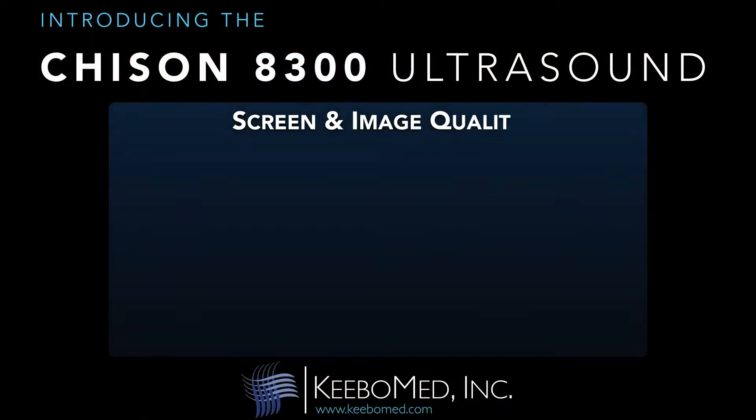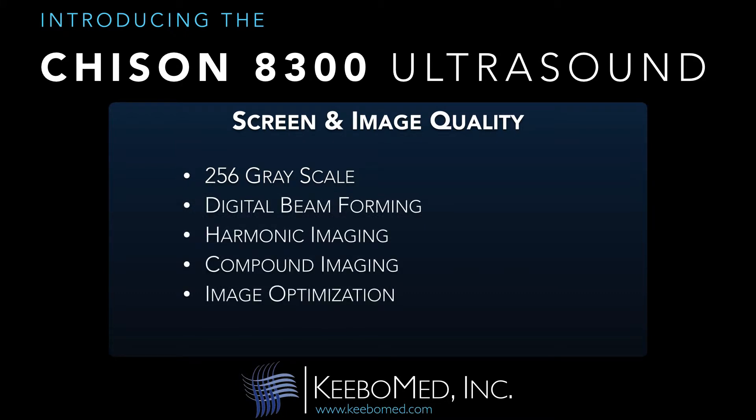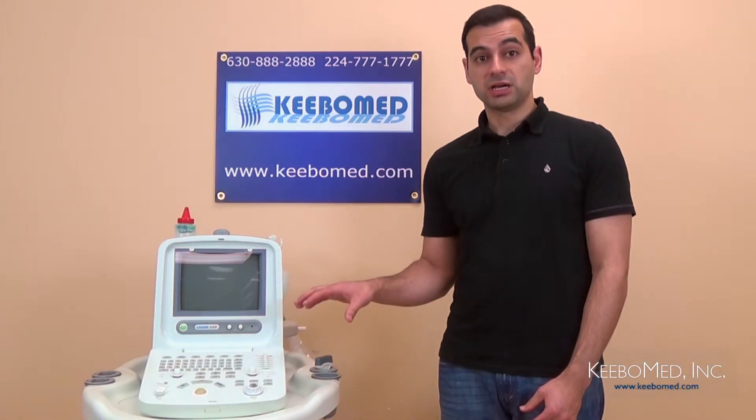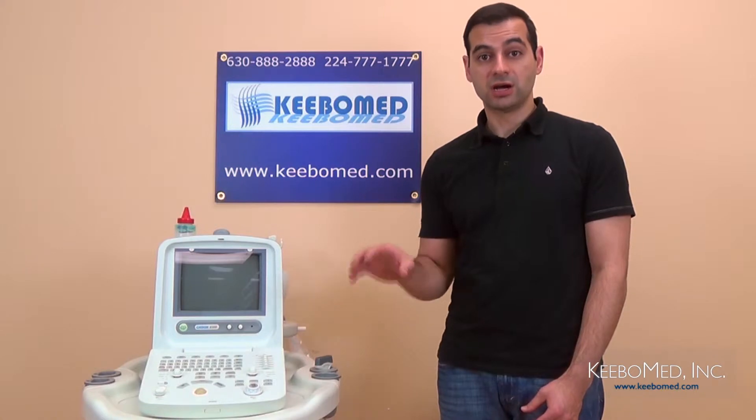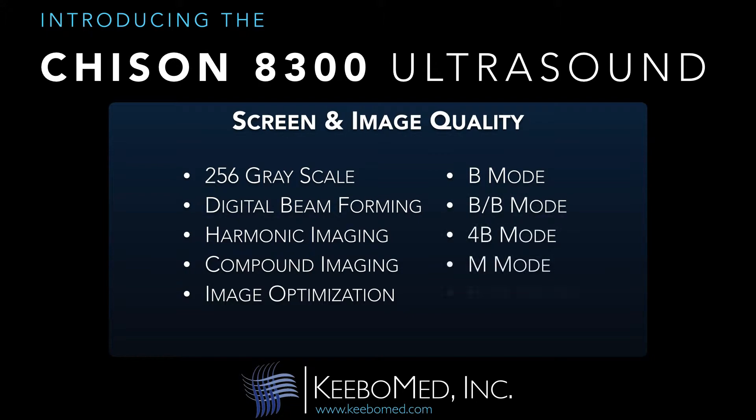It also has 256-grayscale, digital beamforming technology, harmonic imaging, compound imaging, and other image optimization software. The 8300 has five display modes that are commonly used on ultrasounds: B-mode, BB-mode, 4B-mode, M-mode, and BM-mode.